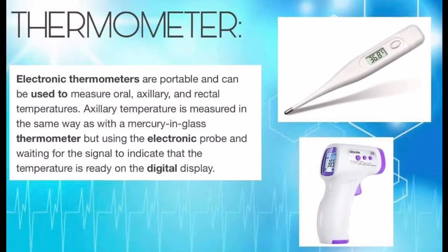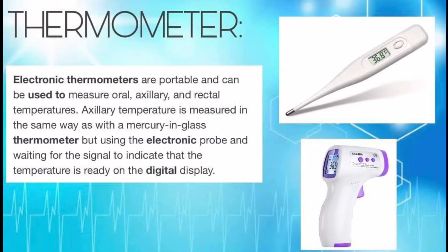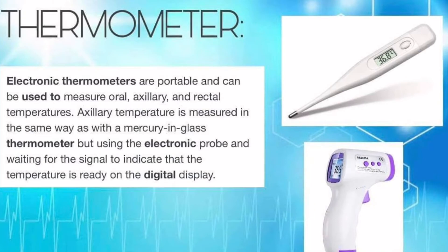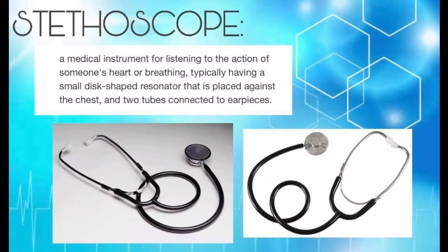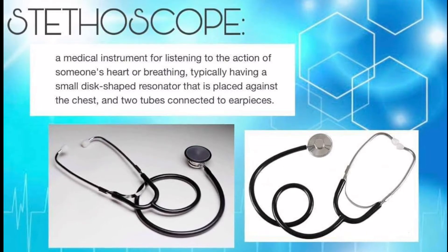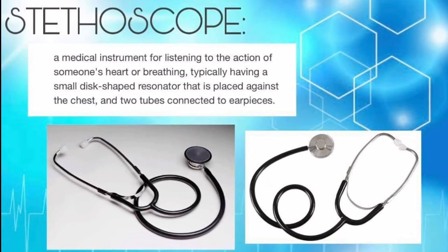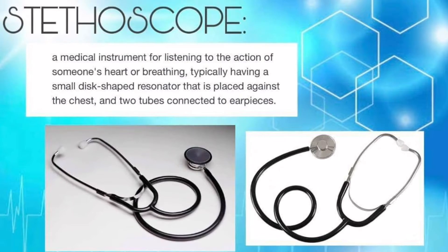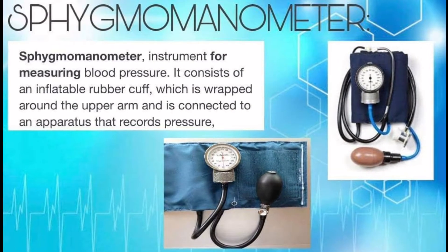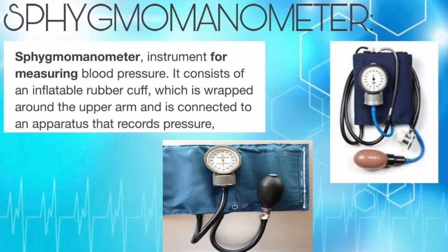This is an example of an electronic thermometer; it will be used to get the temperature of the patient. This is a stethoscope, a medical instrument for listening to the action of someone's heart or breathing. This is a sphygmomanometer, an instrument for measuring blood pressure.